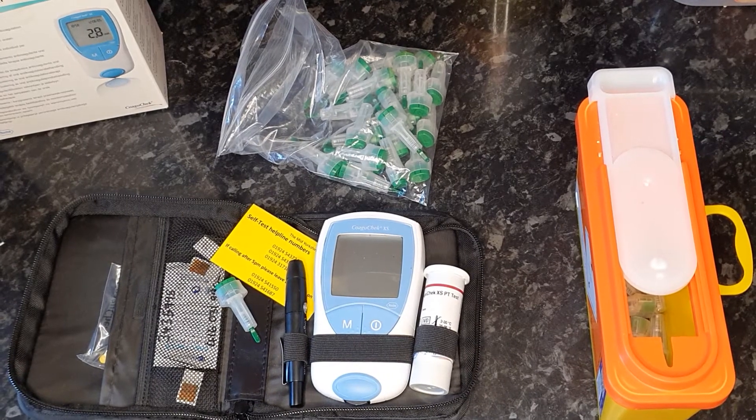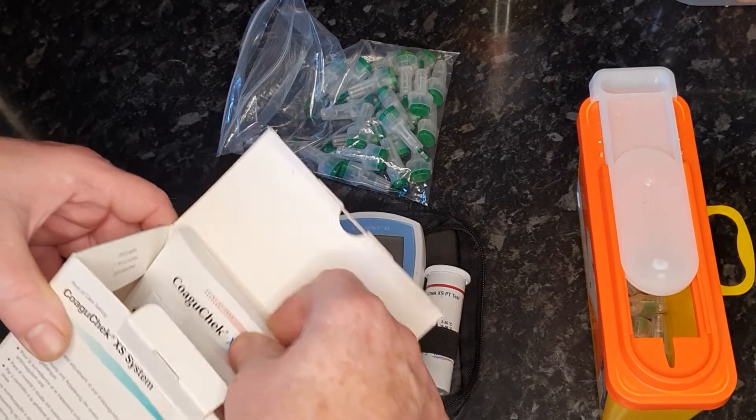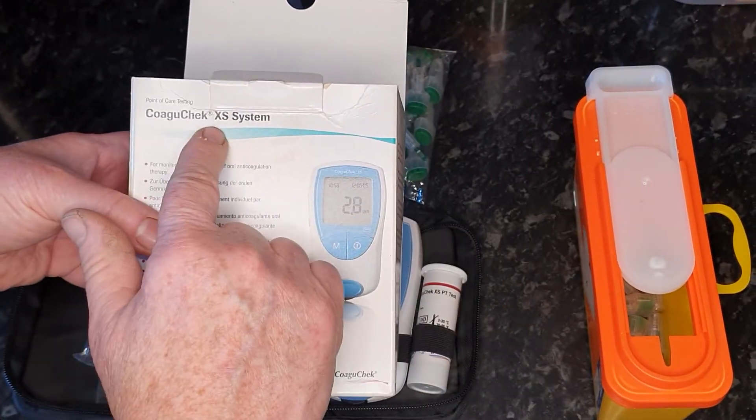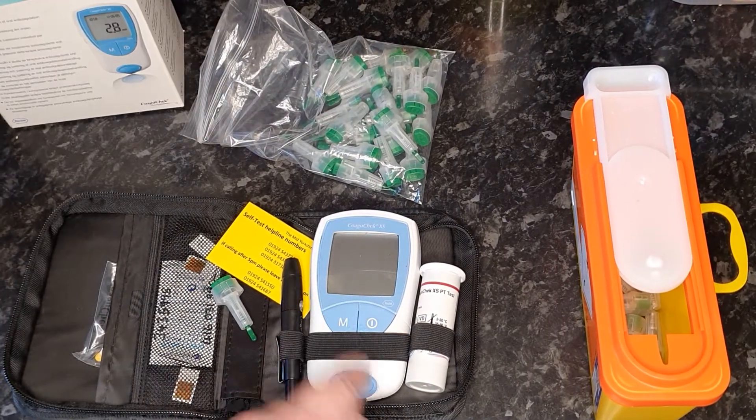I thought I'd do a little video showing what we who are on Warfarin have to go through checking our INR at home. We use a CoagCheck XS system and the hospital will train you in the use of this little machine here, which I'll remove from its case.